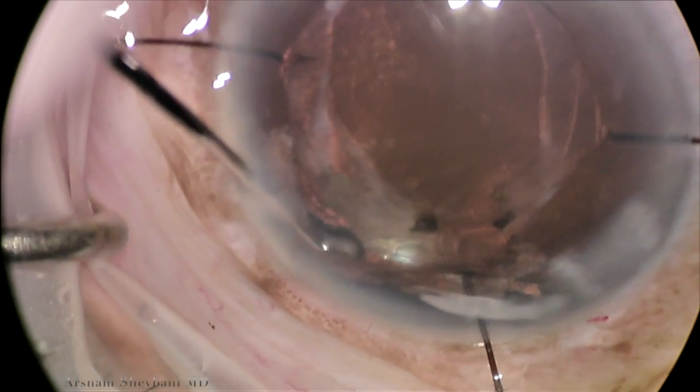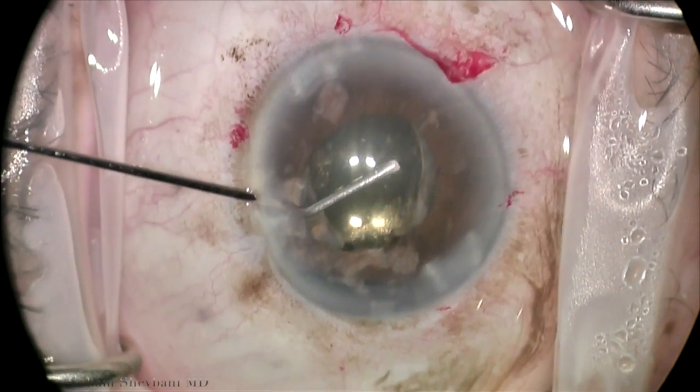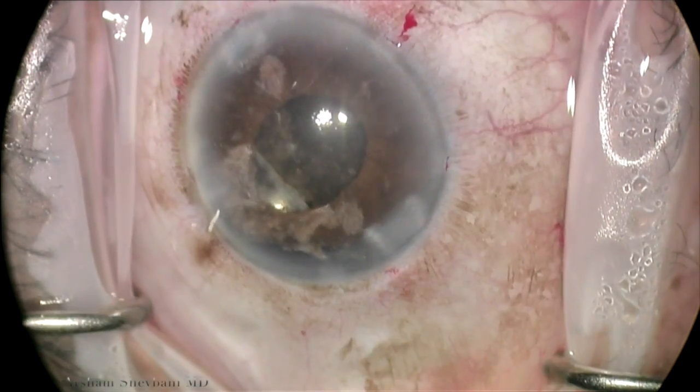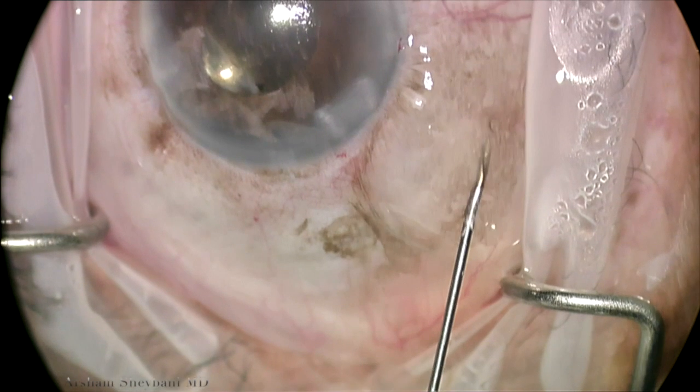We now view with the Kuglen hook that the haptic is within the capsular bag. We remove the viscoelastic manually to prevent vitreous prolapse instead of using an automated technique. And once the wounds are hydrated, we inject dexamethasone.